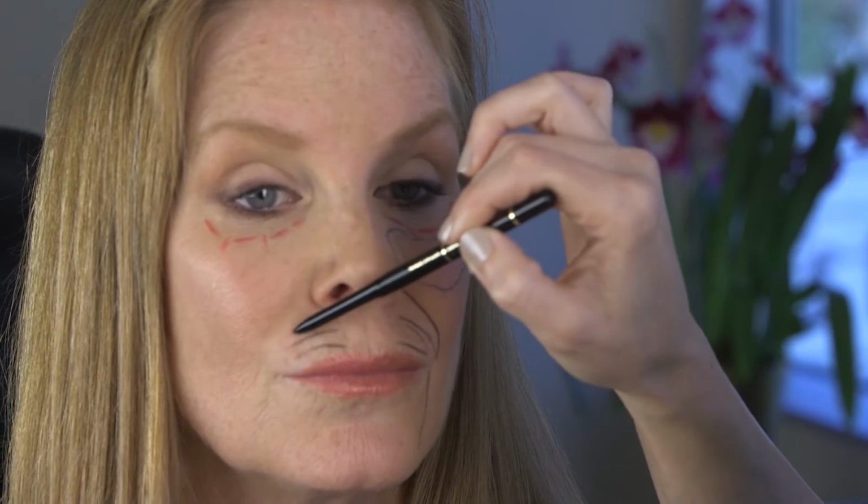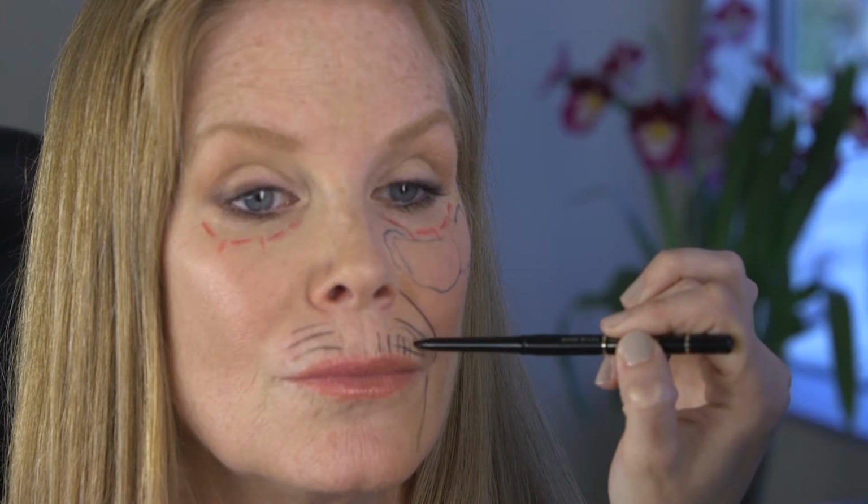You can actually inject the white part of the lip to restore some volume in the fat pads here, but you can also inject individual etched-in lines that you see to restore volume and smooth out some of those lines. It's not often that lines will all go away entirely, and that's not our goal. Our goal is to soften things to keep everything looking natural. And then you can inject the actual pink of the lip itself.